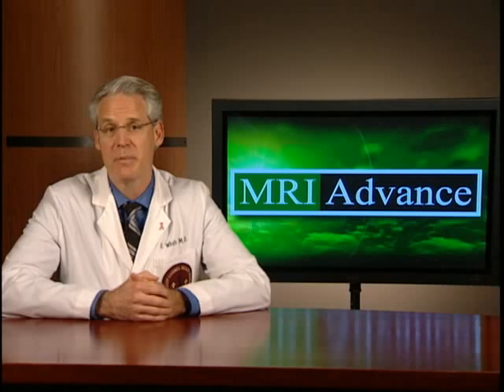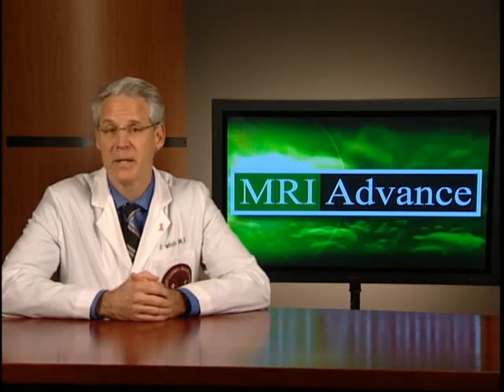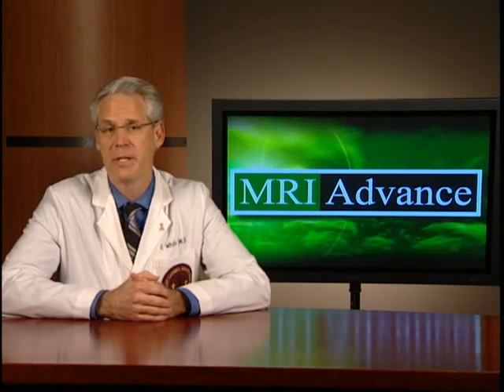Additionally, in this patient population where tumors can sometimes behave in a more biologically aggressive manner, you may not have the luxury of following a questionable signal abnormality as you may in a normal population. For these reasons, we would strongly recommend you gain a significant amount of experience with performing breast MRI and breast MRI interpretation before allowing this population to be imaged.